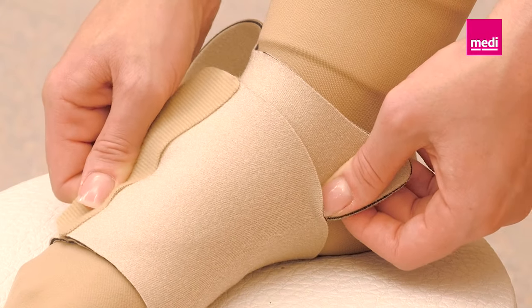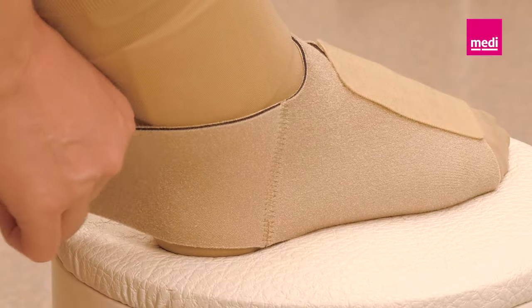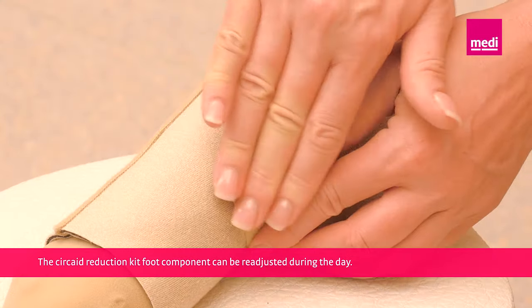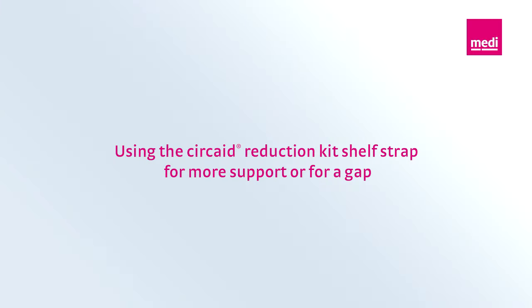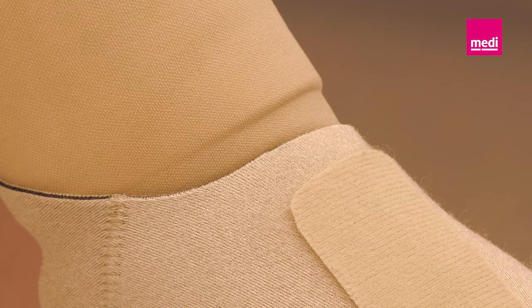Wrap the inner strap over the dorsum of the foot and fasten the strap using the larger hook tab. Pull the remaining strap around the ankle bone with firm and comfortable compression.